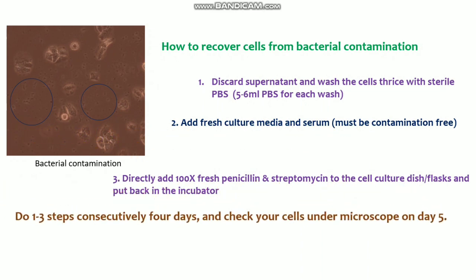You need to do these 3 steps consecutively for 4 days, and on day 5 you need to check the cells under the microscope. You can see the background should be clear, and the cells grow faster than before. This is the indication that the cells are getting better, and also the morphology of the cells will be better. All right.